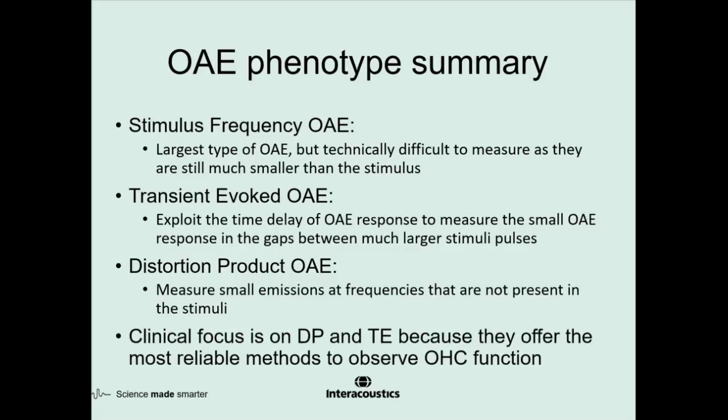So the clinical focus is generally on DPs and TEs, mainly because they are the most robust and reliable ways to measure this phenomenon of amplification and active processes in the cochlea. It's the most reliable method to observe outer hair cell function.